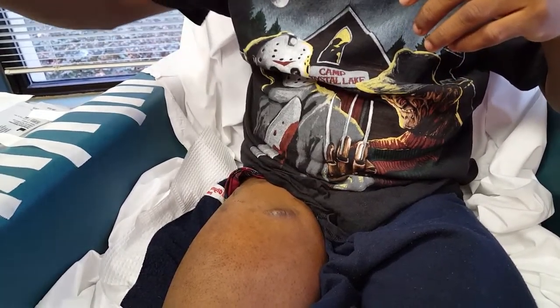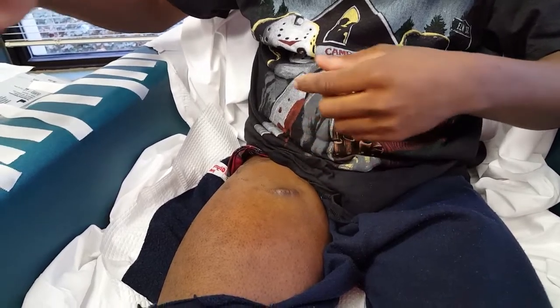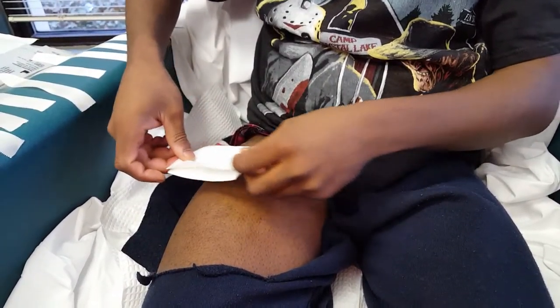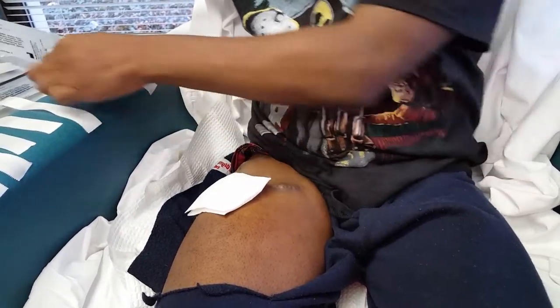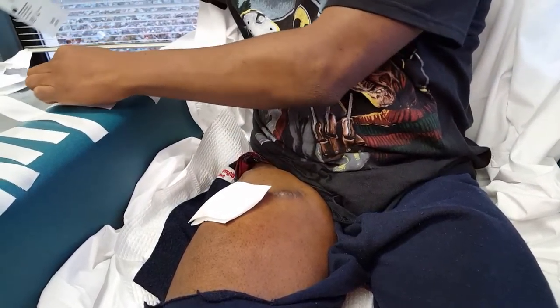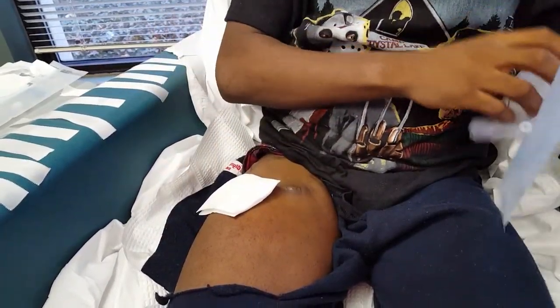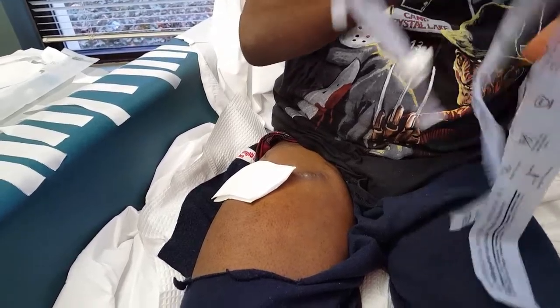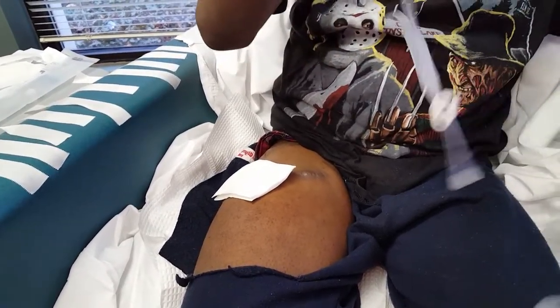Go ahead. Now you don't use this. Yeah, I do, because I have to put it over there in case of blood. Which one are you sticking first? I'm sticking my arterial. I always stick the arterial first. The arterial is the one on the right that takes the blood, and the one on the left returns it.